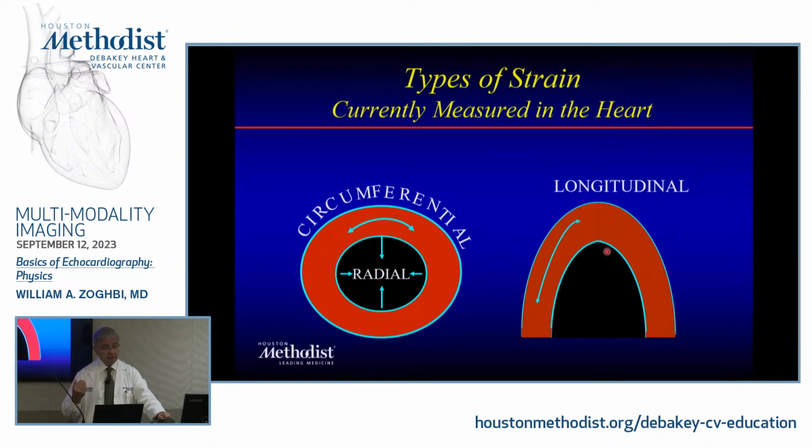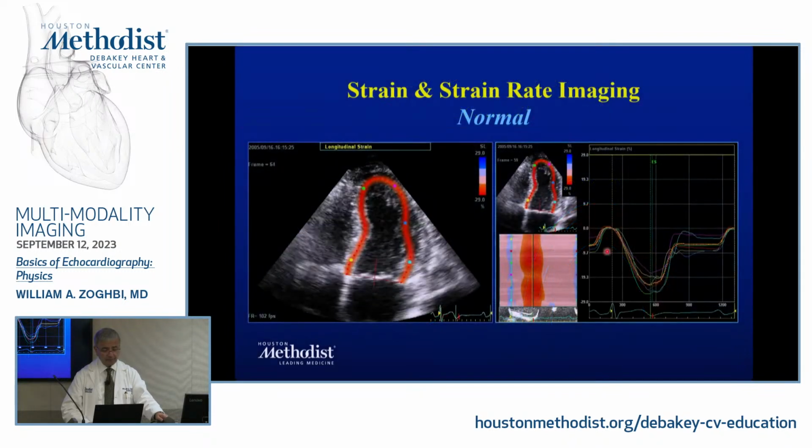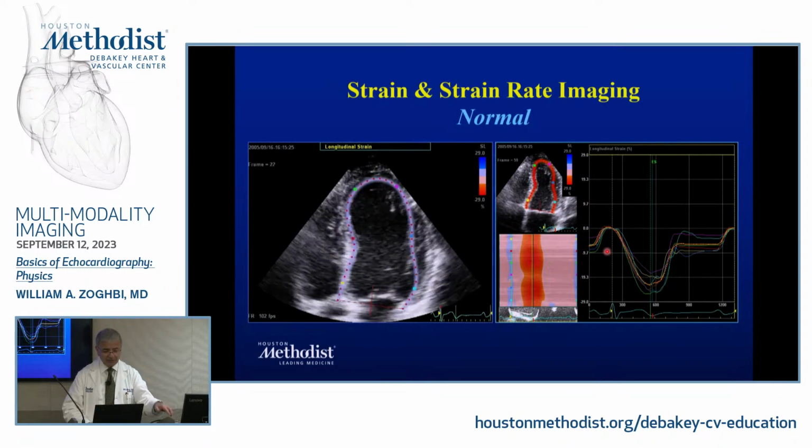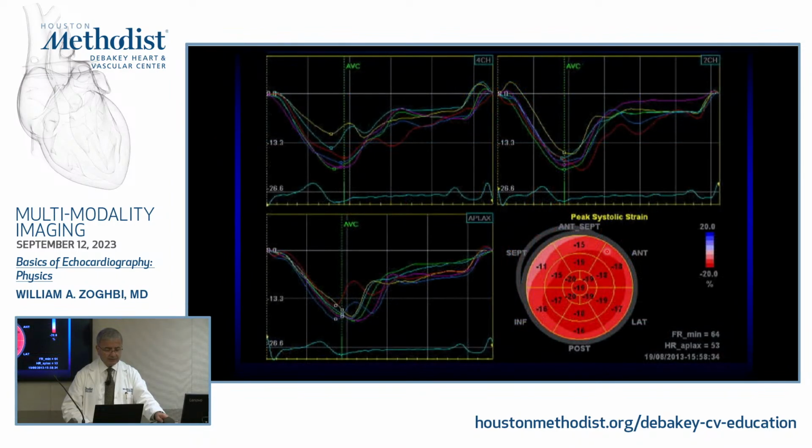Longitudinal strain decreases, EF increases, could be hyperdynamic, radial strain increases, right? So you trade, because of deformation of fibers, longitudinal strain for radial strain. And nowadays it can be automated, which I think is really amazing. Still needs an expert eye to overlook it, because at times the signal may not be as good, etc., etc.